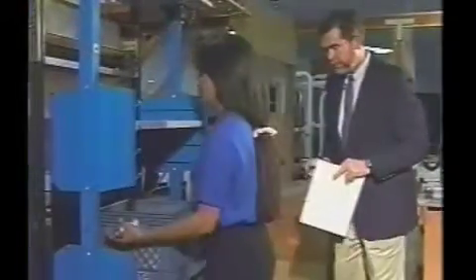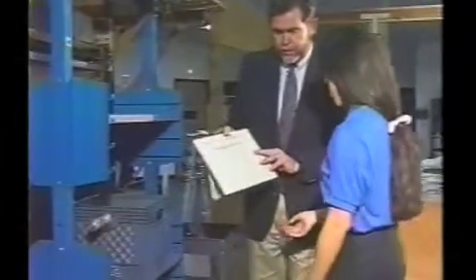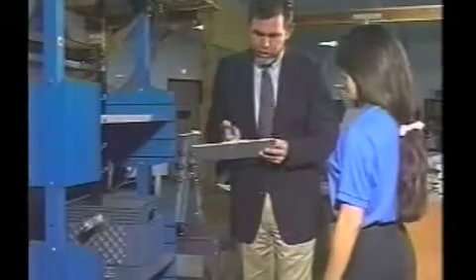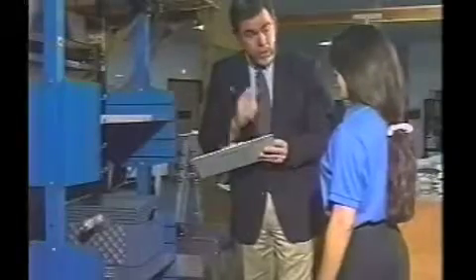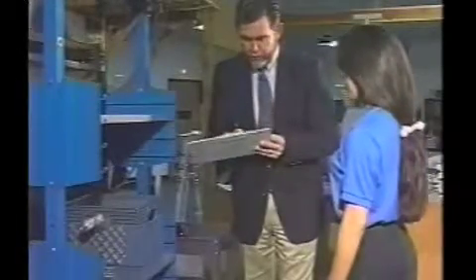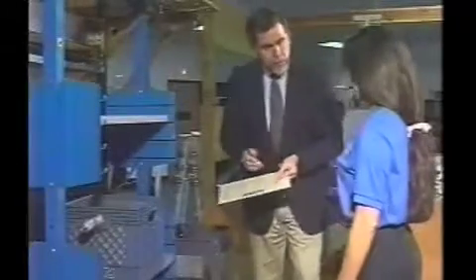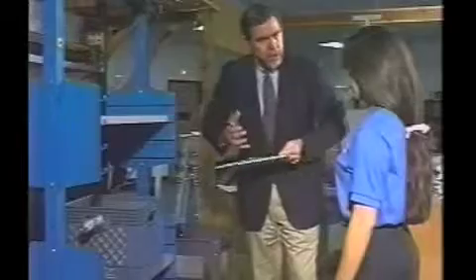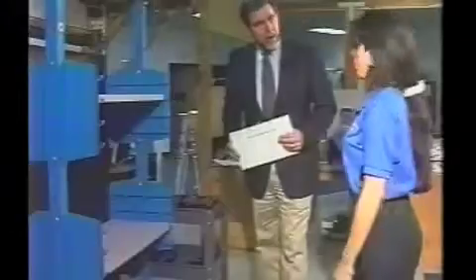There we go. Would you rate that for me, please? [Margaret: About a six.] A six. Could you do that on a safe and dependable basis 8 to 12 times a day? [Margaret: Yes.] Could you handle more weight? [Margaret: No.] And why not? [Margaret: It's reaching a point to where I had to push a little more to get it out.] What you were doing too was coming up on your toes a little bit, so it looks like your shoulders are reaching their maximum ability. Very good. Are you ready? [Margaret: Yes.] Let's go ahead and try this again from the floor up to the shelf.